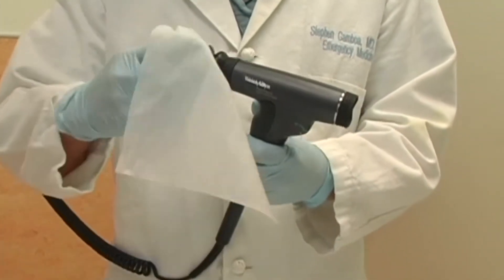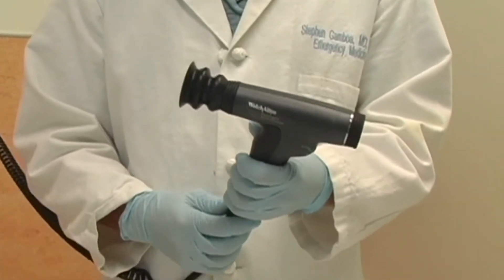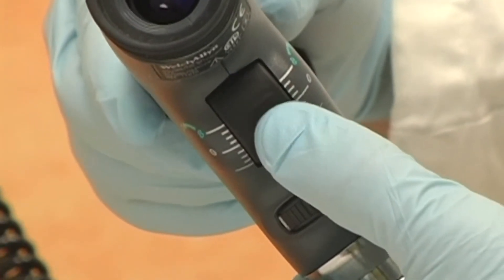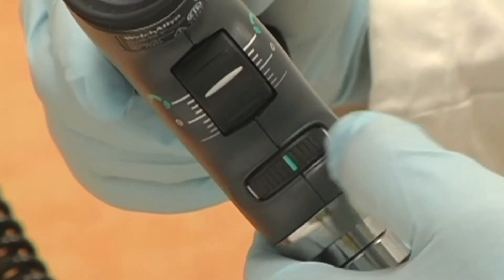Decontaminate the eyepiece before each use. This knob adjusts the focus, and this wheel adjusts the beam diameter.